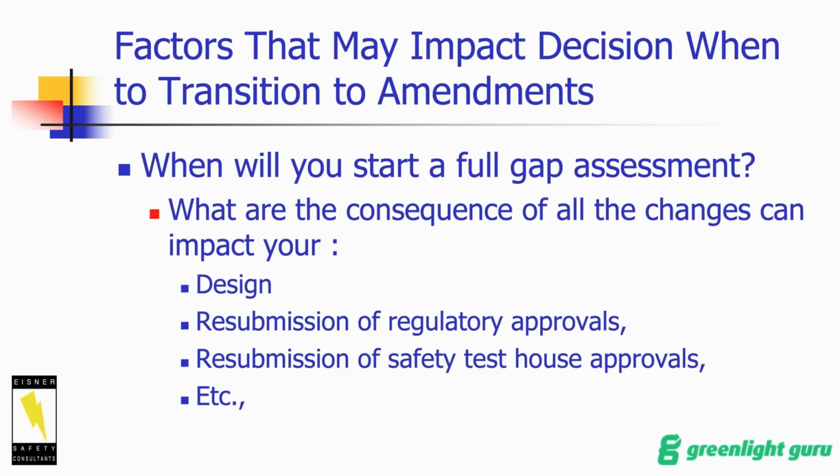When will you start a full gap assessment? Sounds like some of you have started to think about this already, which is great. I think more of you probably need to start thinking about that as well. What are the consequences of all the changes that can impact your design? Resubmission of regulatory approvals, especially over in Europe. Resubmission of safety test house approvals.